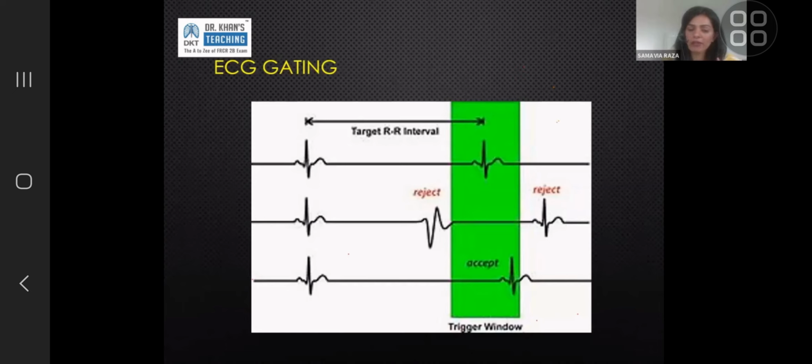The other thing we give a patient just before image acquisition is GTN. This is something patients with angina have. It's an immediate vasodilator. So patients get a GTN spray or a tablet under their tongue just before they're about to start the scan, because it's a rapid action drug and it can also cause reflex tachycardia. The reason we do that is to have instant vasodilation. You want every vessel to be as dilated as it can be, because these are very small caliber vessels. They're really hard to see. The better the caliber we can achieve, the better it is for interpretation.